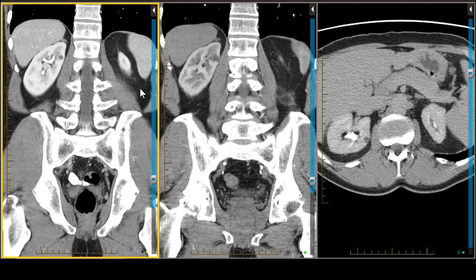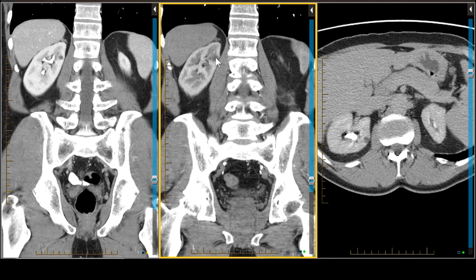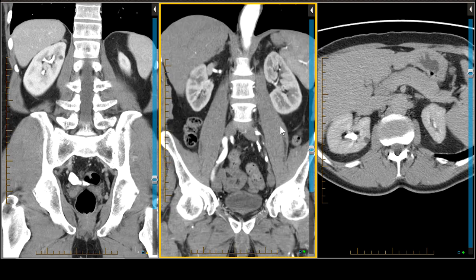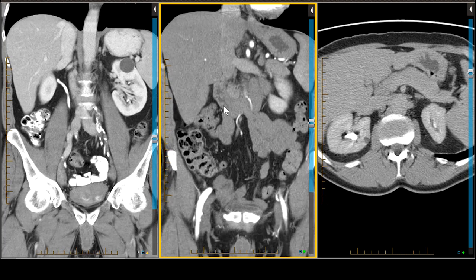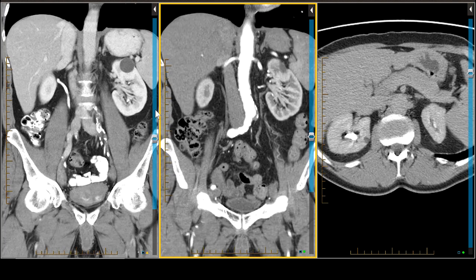When we get a lesion like this — in 2017 it looked maybe seven or eight millimeters, and in 2019 it's slightly larger — we do Hounsfield units on it and get a value of 50. So it's an indeterminate lesion that's grown to about a centimeter. Should we ignore it, watch it? We don't have a baseline unenhanced CT to determine if it enhanced or not. That's one of the classic reasons why we're asked to evaluate somebody with MRI.